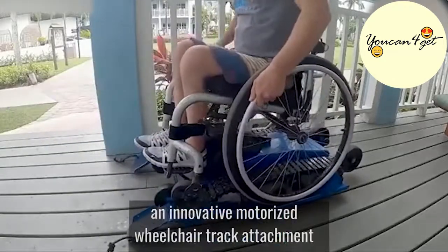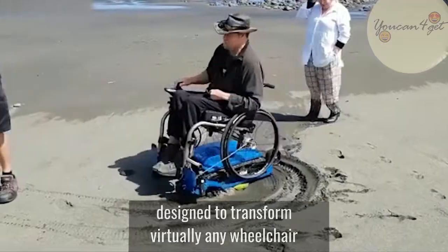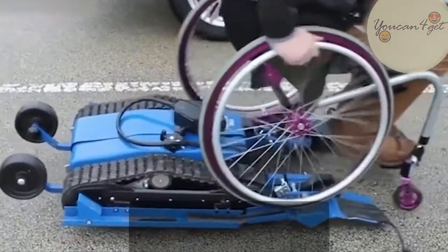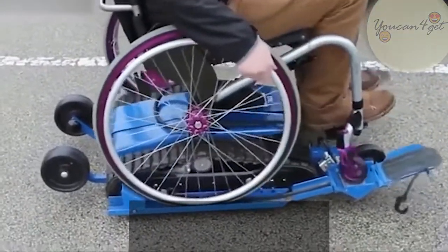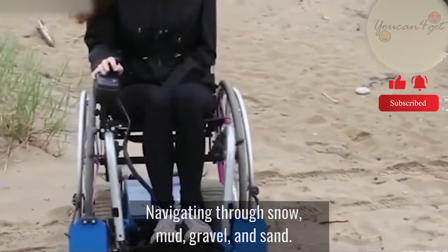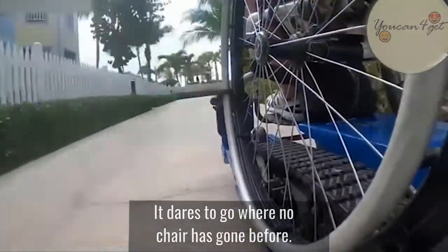This is the Freedom Tracks, an innovative motorized wheelchair track attachment designed to transform virtually any wheelchair into an off-road vehicle. This liberating device can tear through all terrains and weather conditions, navigating through snow, mud, gravel, and sand. It dares to go where no chair has gone before.